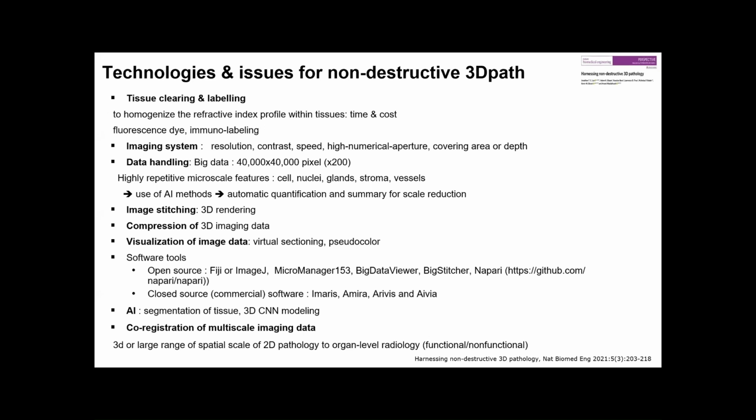3D or large range of spatial data of 2D pathology can be used in co-registration analysis of multi-scale medical image data.